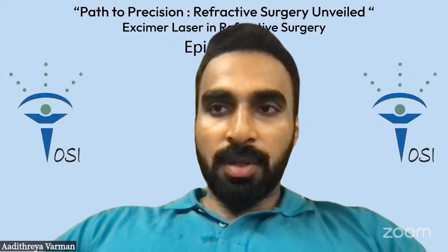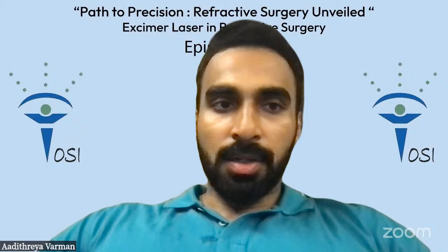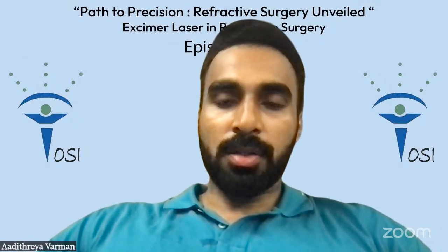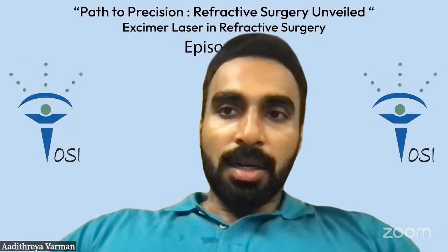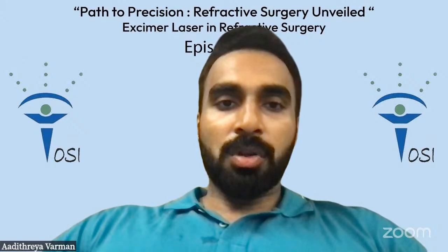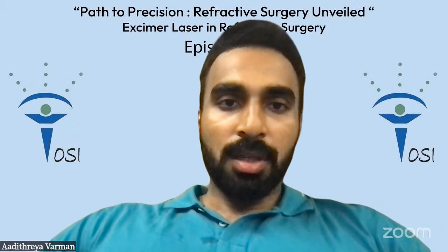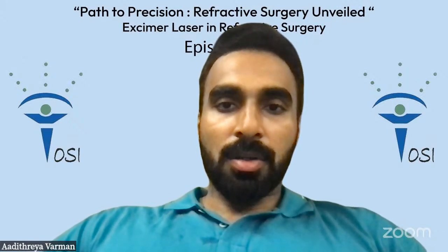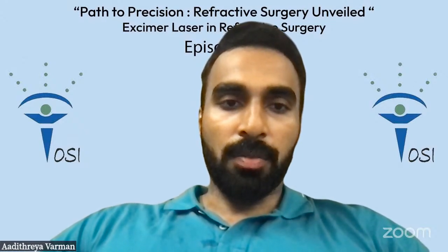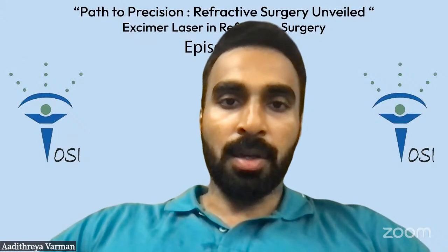I always believe that even though lenticular extraction is gaining traction and is probably the present and the future of myopia correction and refractive surgery, PRK is not going to go away. There might be lesser adoption of LASIK in the upcoming years, but for sure there are indications such as borderline corneas and low myopia, where PRK will be necessary, especially with enhancements.